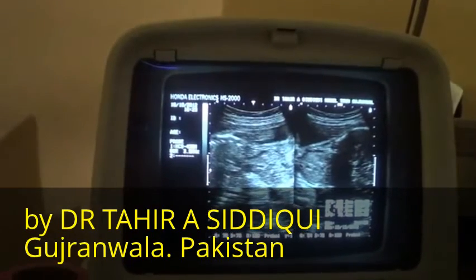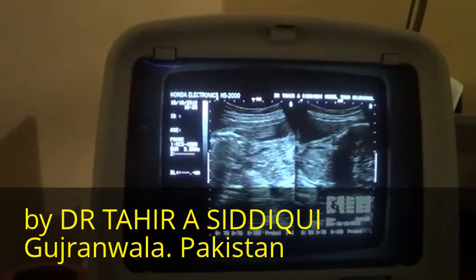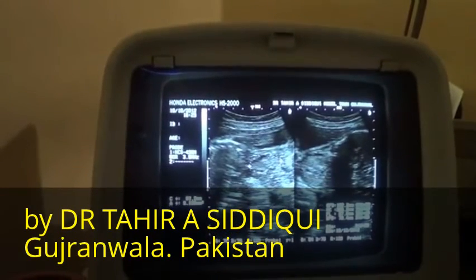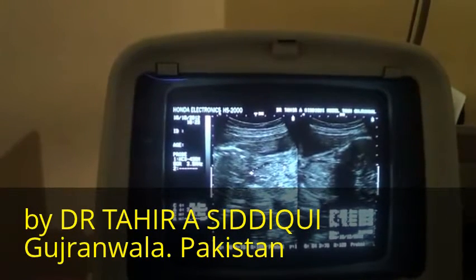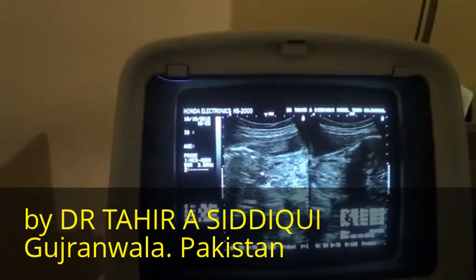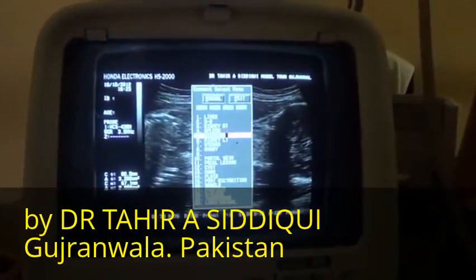So these are the vessels, and this is the lobe of the segment. This appears to be the posterior lobe of the mass, and this appears to be the anterior part. So a bilobed mass can be a thyroid mass.